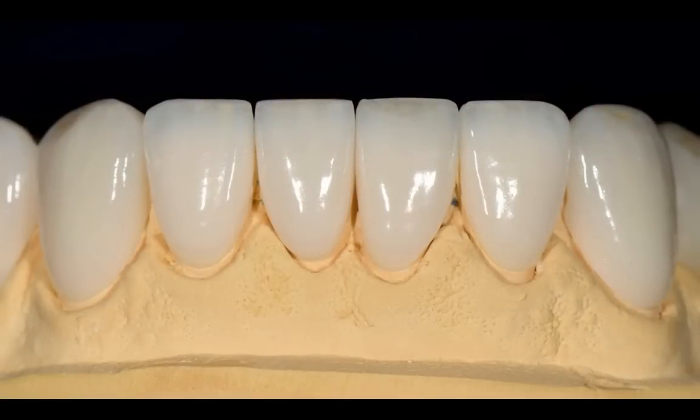Here are the final porcelain restorations. These are layered ceramics, so all the effects are layered from the inside out — it's not stained. The monolithic emacs is stained, but in the anterior aesthetic zone, I want the effects layered from the inside out so that we get great aesthetics.